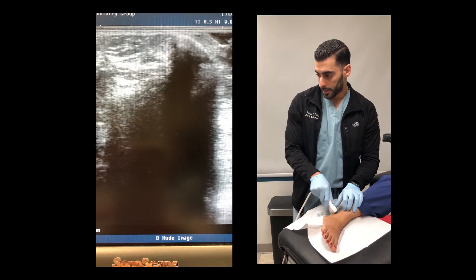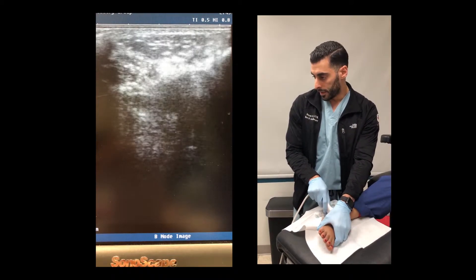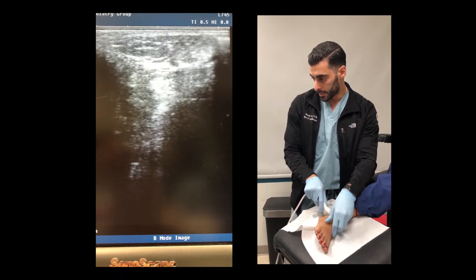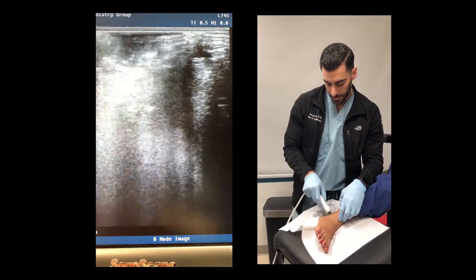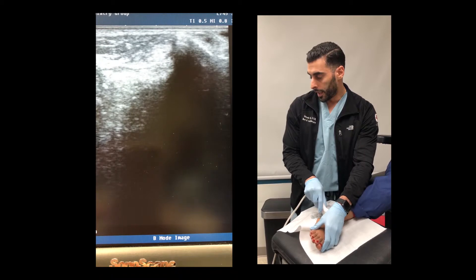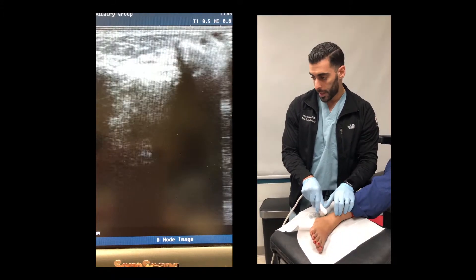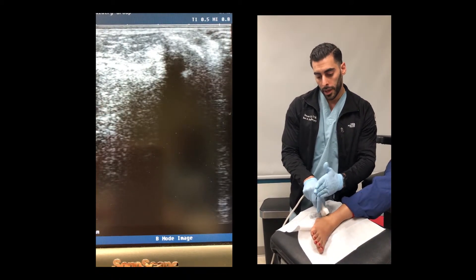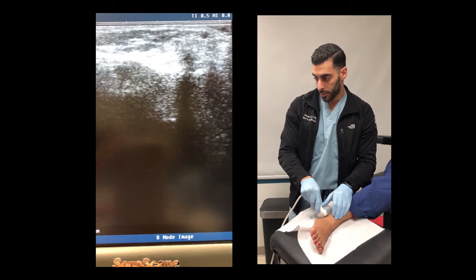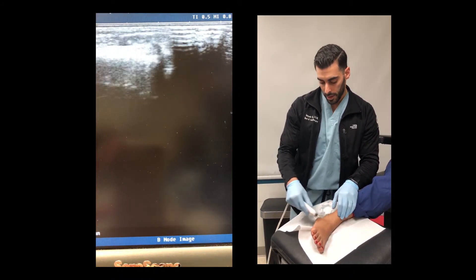Right away you see the fibula come in. What I absolutely love about this imaging modality is how you can move the foot and see those tendons running right by the distal tip of the fibula — let me get some more gel here. We know that the peroneus longus runs inferiorly to the peroneus brevis, so we were able to identify those structures. This is a little bit difficult because of the curvilinear nature of this tendon, so you have to make sure you keep the probe down to avoid anisotropy. We're working our way around, seeing those tendons, and then I'll switch to the longitudinal view.